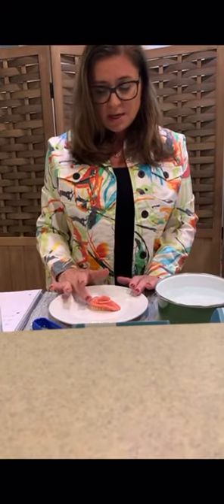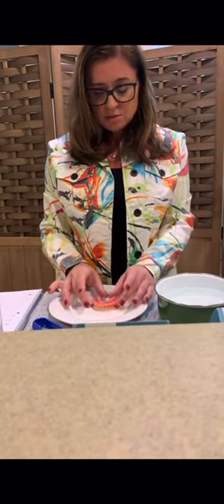I do want to show you that even before the 60 seconds is up, I can touch this. I don't find it to be uncomfortable at all. I can even pick it up.